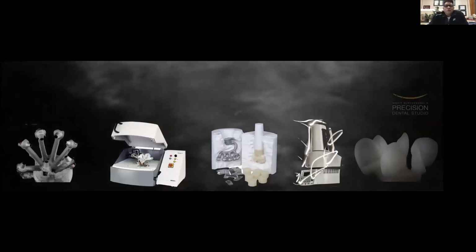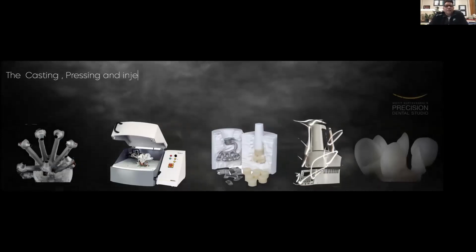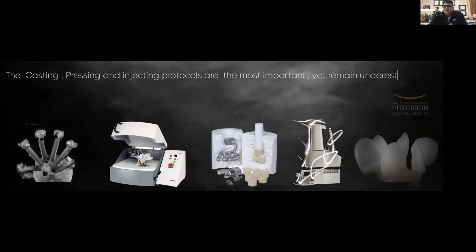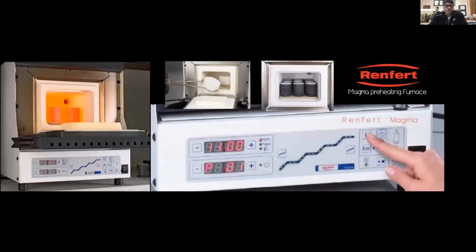Most importantly, with all these factors, whatever we are fabricating in the lab, the casting, pressing, and injecting protocols are the most important, but they still remain underestimated. We don't give them the importance that is required, because these are the factors that make your restorations. That's the base of the restorations.